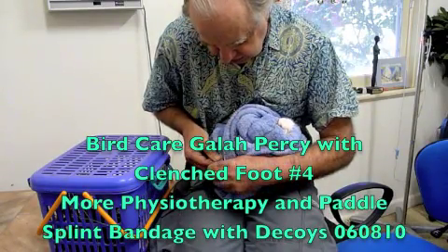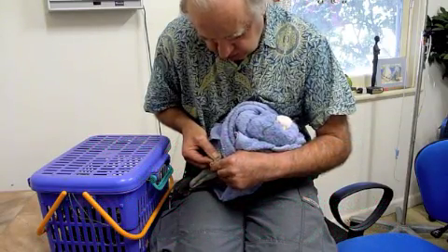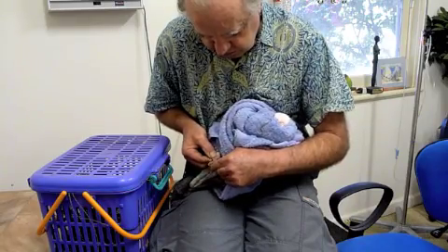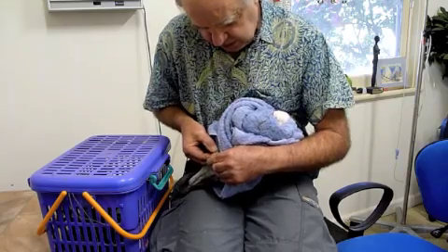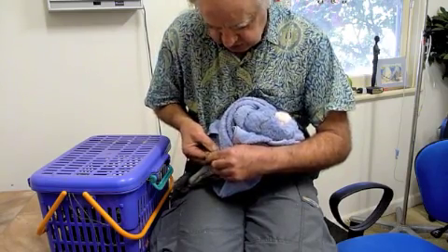The rear toes in the normal standing position. I'm now doing some work on the equivalent of our heel, commonly called the hock joint. It's not truly a hock, but the tibiotarsus, which is this bone here, and the tarsometatarsus, which is this one here.